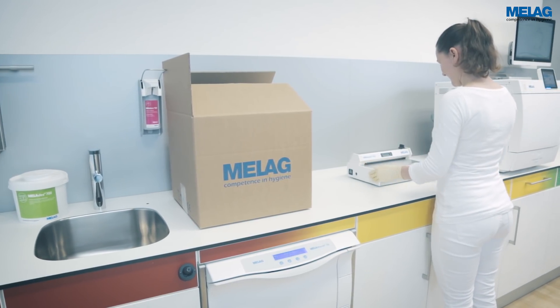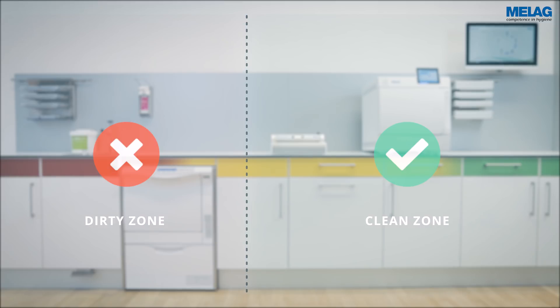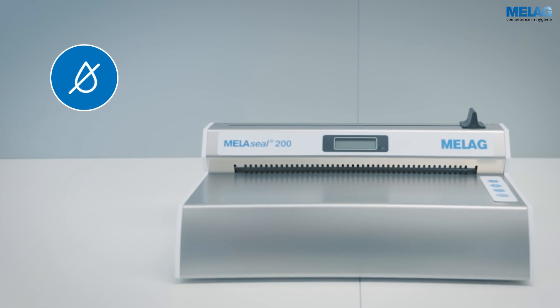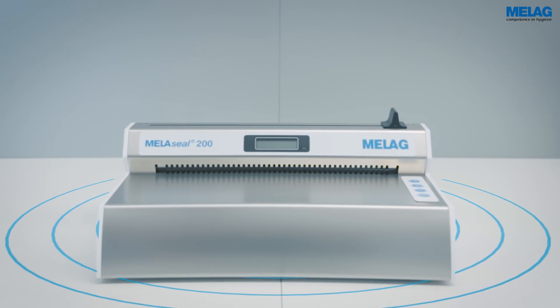The sealing device is placed on the clean zone of your decontamination room. Should you choose a different installation location, please ensure that you maintain a minimum 1.5 metre distance from the treatment location. The installation site should be dry, protected from dust, and may not be in direct sunlight or in proximity to other sources of heat. Please provide sufficient lateral clearance to ensure good access to the MieleSeal 200.